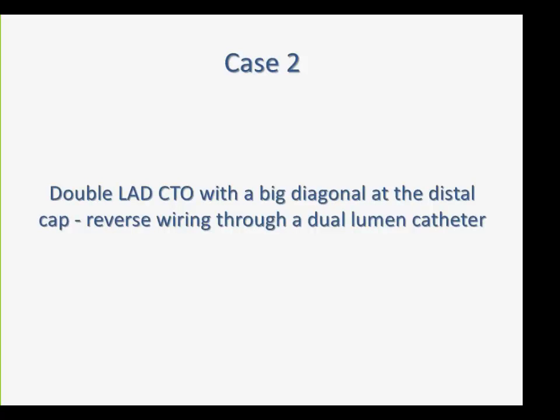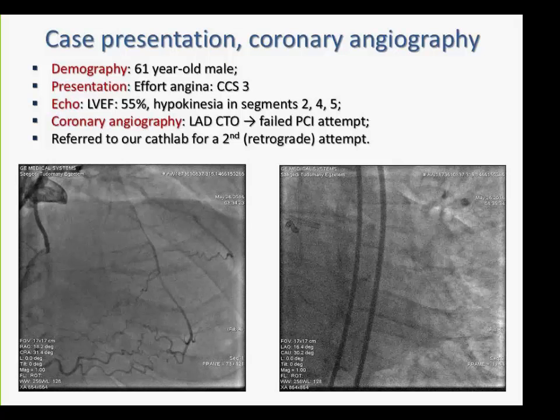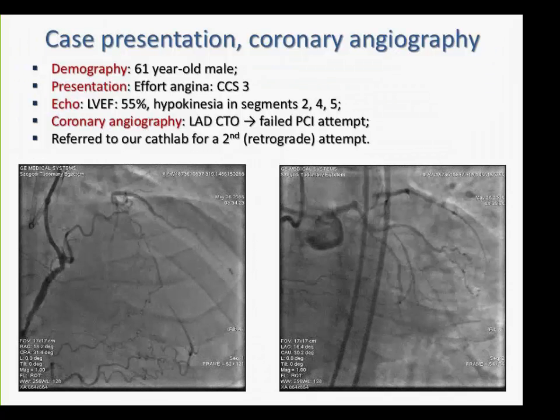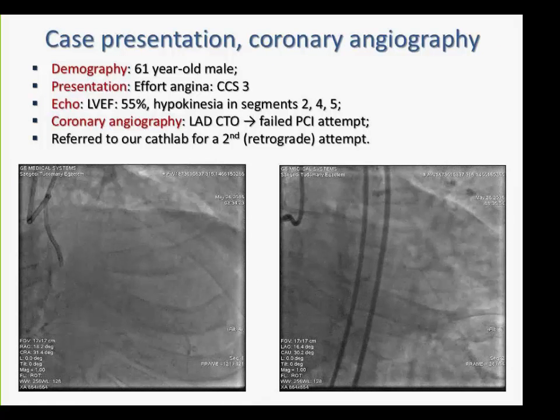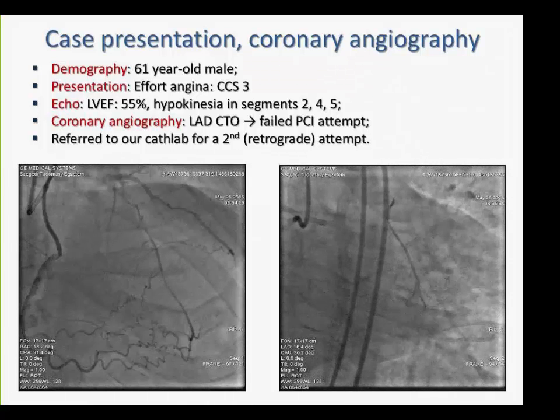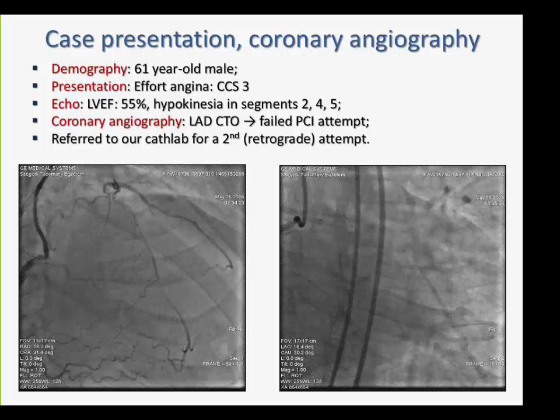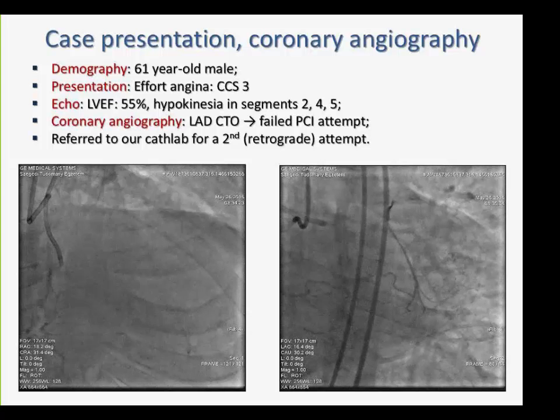So actually, this gentleman is a 61-year-old male patient with CCS grade 3 angina. In another hospital, ostial LAD occlusion was revealed, and they did an antegrade attempt, which was a failure. So they referred him to our center for a retrograde recanalization of the LAD.